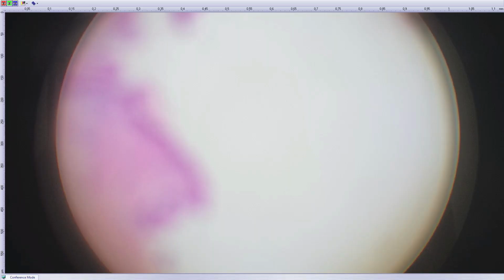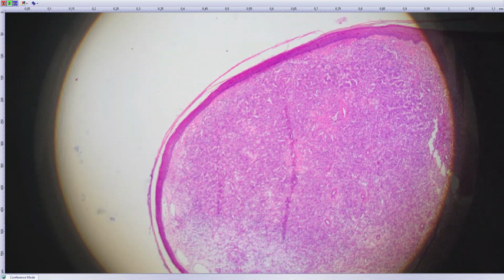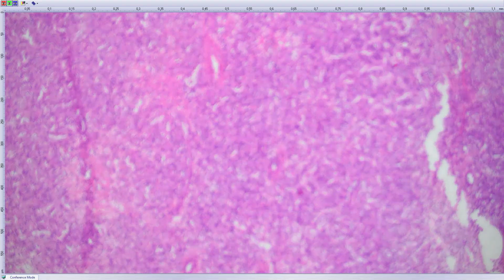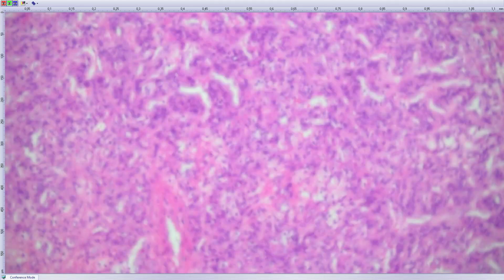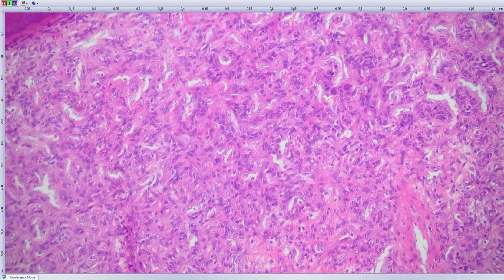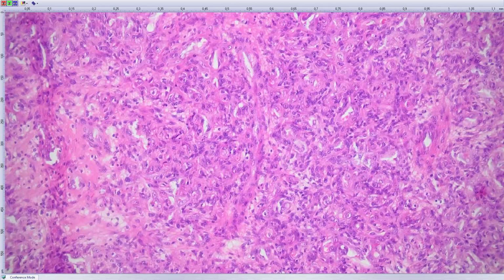Here I have again a new tumor of soft tissues. You see subcutaneous tumors, and it's quite cellular. Yeah? You might even think that it's a type of hemangioendothelioma, which is a low-grade angiosarcoma. Yeah? There is a mild atypia in it, some foam cell proliferation.